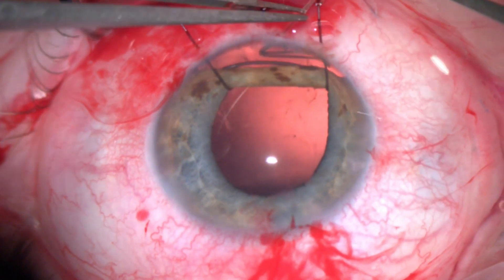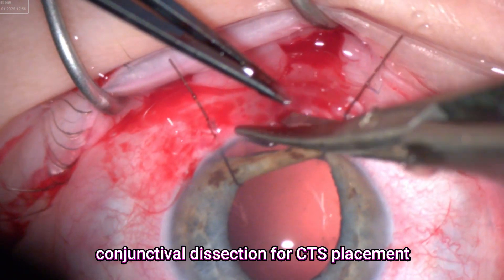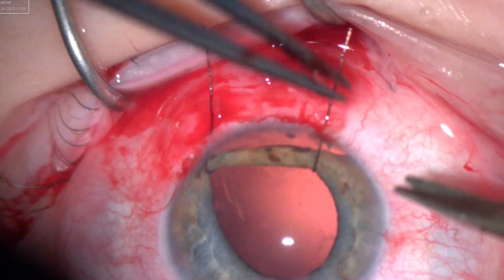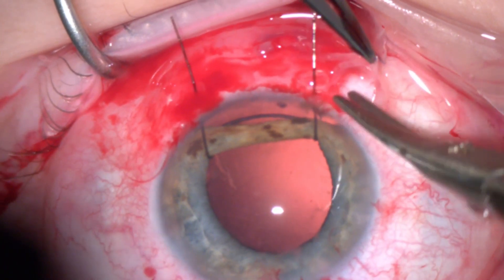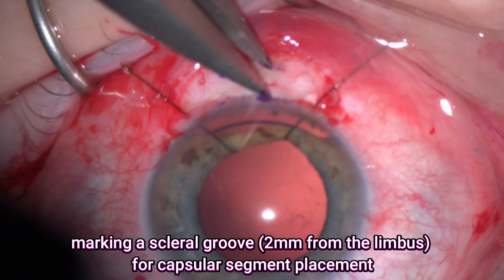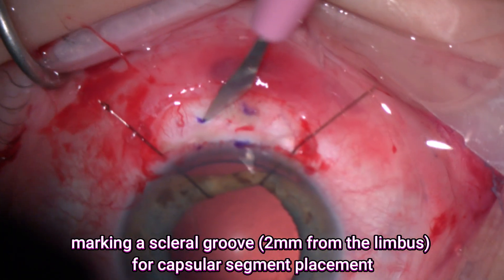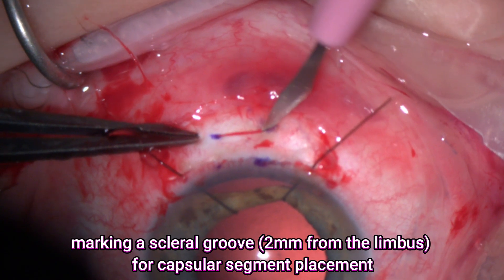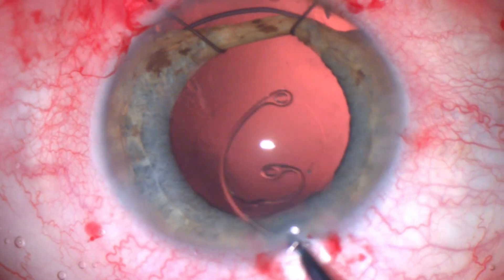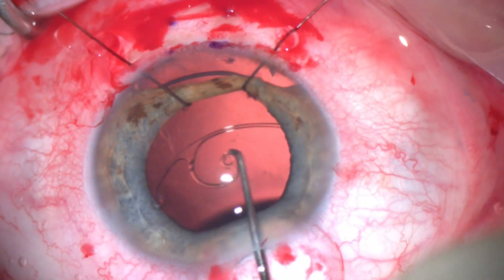This is followed by removal of the capsular retractors and injection of some viscoelastic. Then I decided to place a capsular tension segment. Usually a CTR is enough if there is about two or three hours of zonular weakness, but in this scenario there was about five to six hours of zonular weakness. So I decided to put an extra support of a capsular tension segment. I made a groove about two millimeters from the blue line.